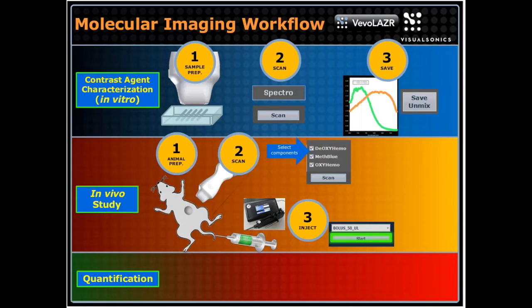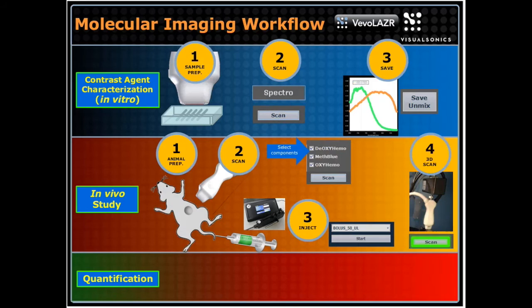We've got an injector pump which is hooked up to the Vivo software. So we can, as we're imaging in real time, observe the uptake of a given contrast agent. And then of course we can scan in 3D as well to be able to get volumes.